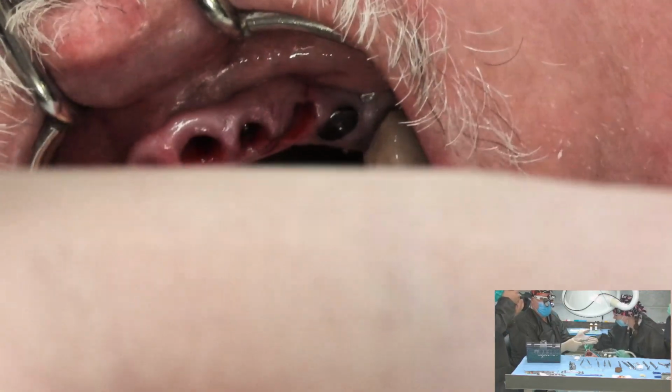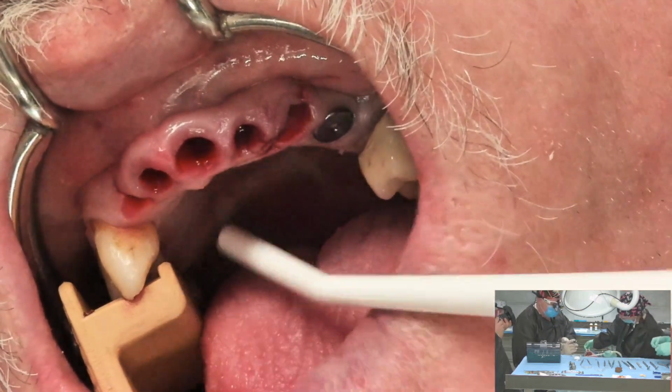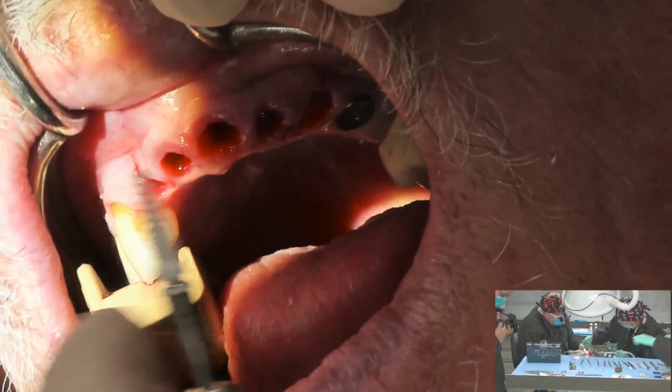So, this is the one piece. Is that good? Blakey, good? Yeah, go ahead. One piece, 4.0 Z-Systems tapered screw implant. This is 95% of the zirconia implants I put in. Shape and size 502. Showing a lecture a little bit too. All right. Let's go. We'll start with number 10 site.